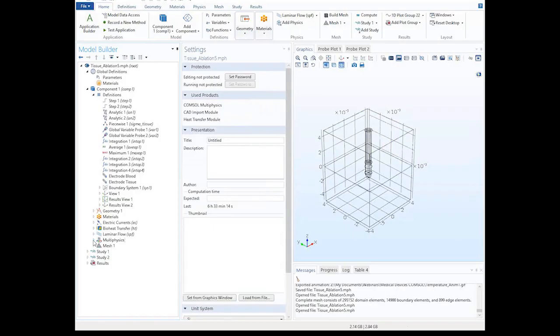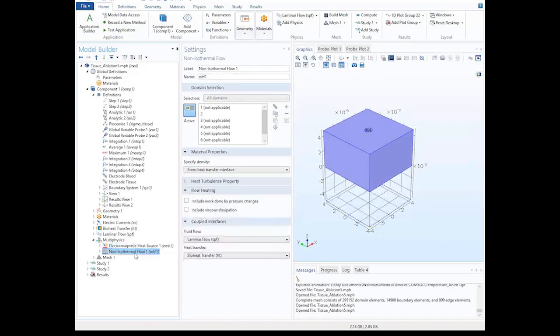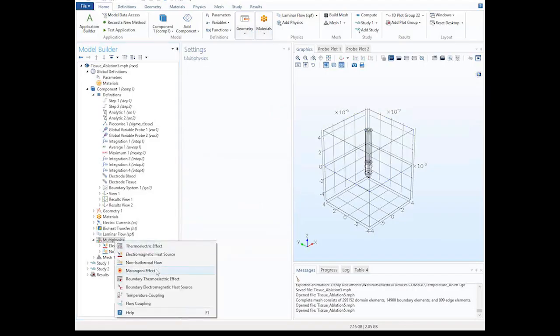There's a node that COMSOL adds here for the types of multiphysics coupling, and it gets automatically populated. So there's an electromagnetic heat source that couples the heat with the electrical equation, and there's non-isothermal flow in the fluid. Temperature affects flow and vice versa. You can add other forms of coupling if needed, and then it will take care of the rest.